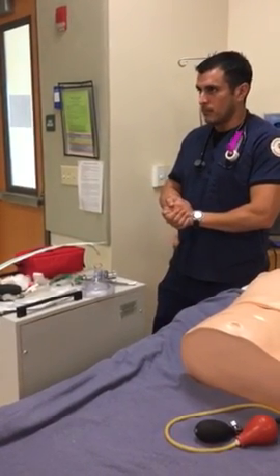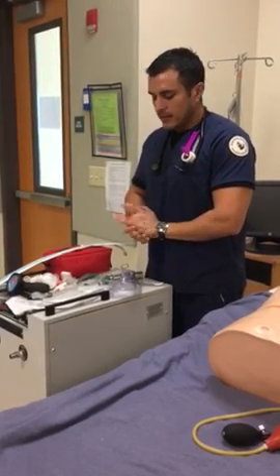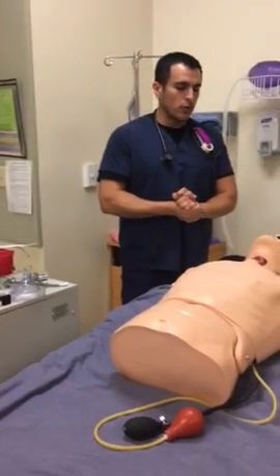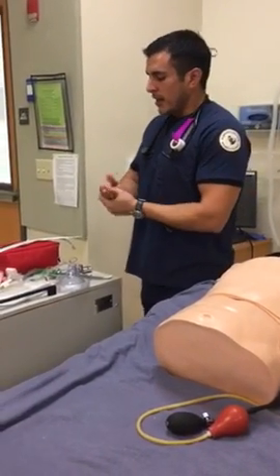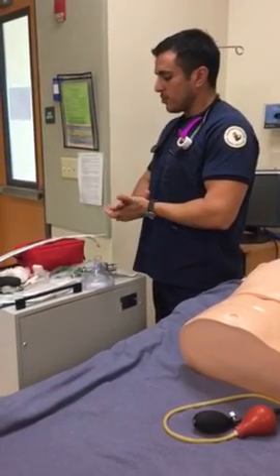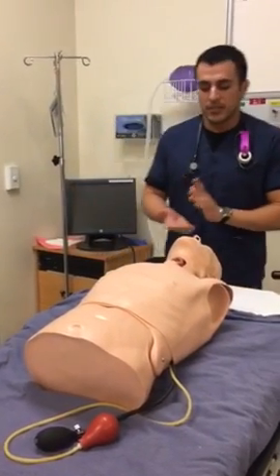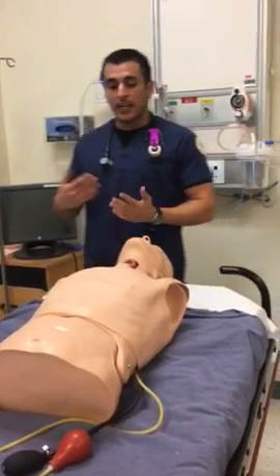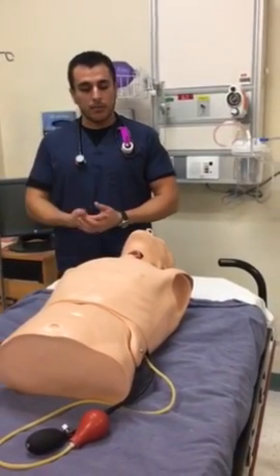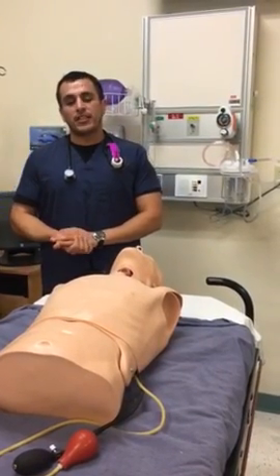The next thing that we're going to do is wash our hands, and we are going to enter the patient's room, and I'm going to introduce myself to the patient and explain the procedure to him. Hello patient, my name is Daniel. I'm from respiratory. Can I have your first and last name and date of birth, please? And can I see your bracelet, please? So we would get our patient identifiers.